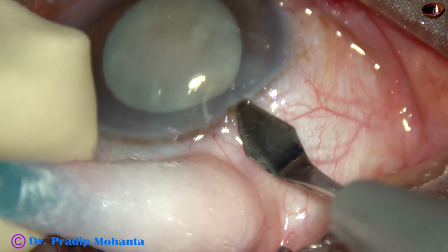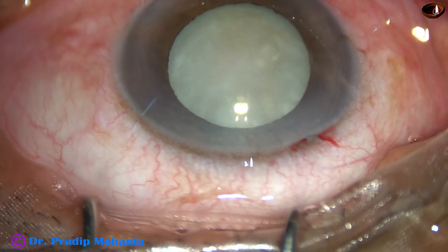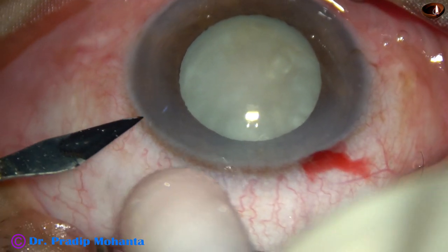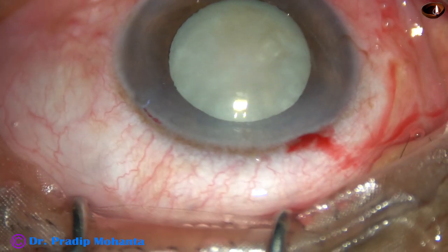This is the main incision with a 2.8 mm steel keratome at the posterior aspect of the limbus. And now, this is a side port, about 3 o'clock hours away from the main incision.